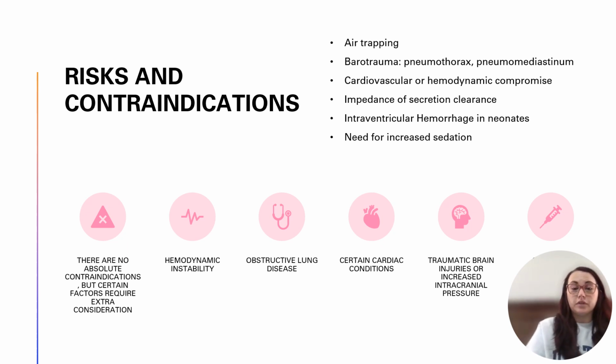If you have obstructive lung disease, certain cardiac conditions, or traumatic brain injuries, that's a big one, because again, you're increasing that intrathoracic pressure. And when you increase that intrathoracic pressure, you can also increase the intracranial pressure.